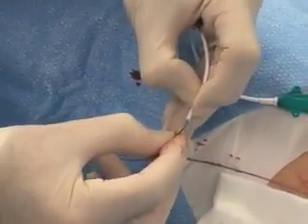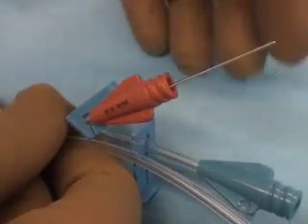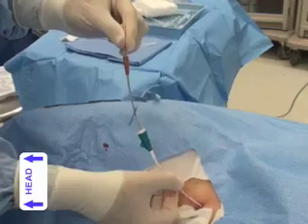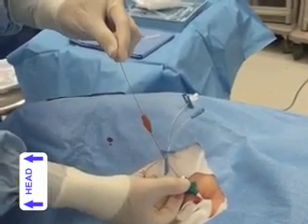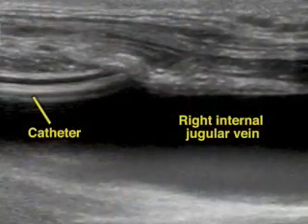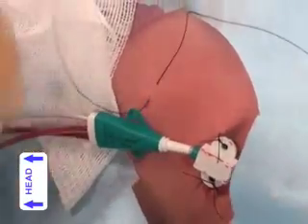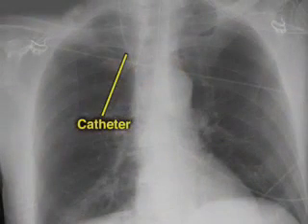Insert the guide wire through the distal opening of the central venous catheter until it exits through the proximal end. Secure the proximal end of the wire to prevent inadvertent advancement into the vessel, then advance the catheter into the vein. Hold the proximal end of the guide wire at all times when advancing the dilator or catheter to avoid complications from unintended advancement. Using ultrasound, verify that the catheter is properly placed within the lumen of the vessel. Once proper placement is achieved, remove the guide wire and anchor the catheter to the skin with sutures. Each port should be flushed with saline solution, and a chest radiograph should be obtained to confirm proper catheter placement.